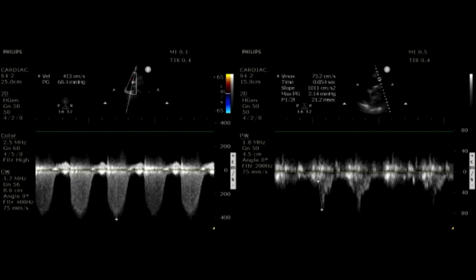And then we add on our IVC, and it's going to be anywhere from 3 to 10 millimeters of mercury higher than that. So the question I have is, what are some of the pitfalls that we may run into as we're trying this technique on patients that we need to keep in mind? We'll start broad, and then I have some other specific questions that we can drill down on for this one. Yeah, so I think the key here is that tricuspid regurgitation jets can be fickle.